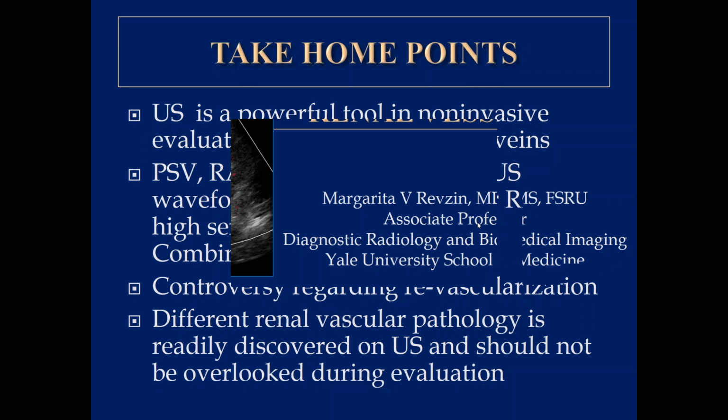However, sometimes physicians who refer the patients just want to know if there is any other reason why the patient may have elevated pressures, may have renovascular hypertension or just hypertension. So by stating to them that something is abnormal, like if we do find stenosis, we could solve their quest for diagnosis. What does the patient have? And then they can decide if they want to do anything with it, or most likely they will not. But at least they're going to have an answer to their question and maybe narrow their differential diagnosis if we diagnose it as a renal artery stenosis.